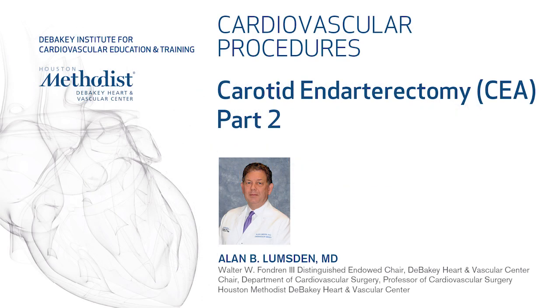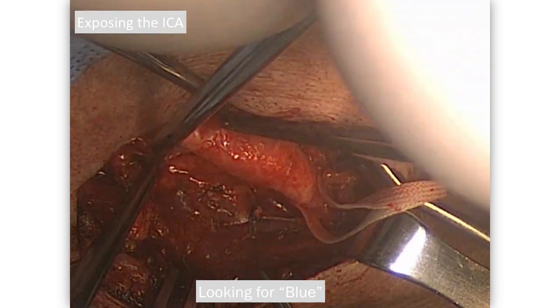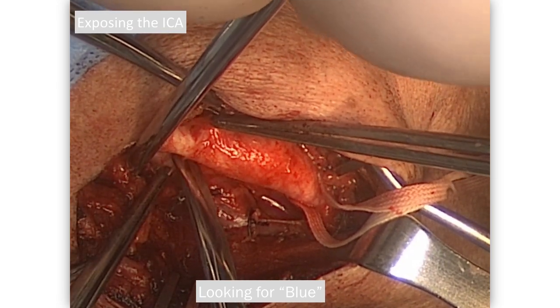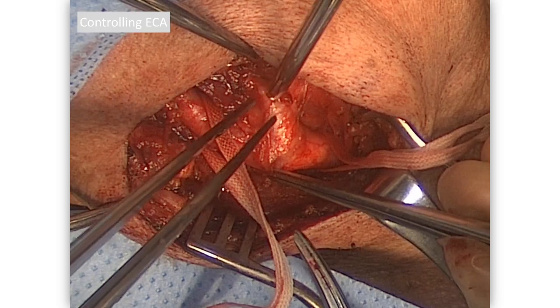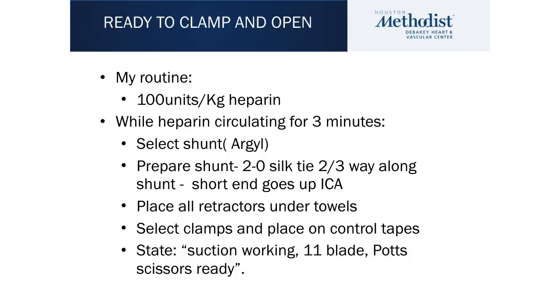In part 2 of this video on carotid endarterectomy, we are going to take it up at the point where we have already dissected out the internal, the external, and the common carotid artery. We already talked about looking for blue as we dissect distally and get in control of that, as shown at the end of part 1. Here we are controlling the external carotid artery.